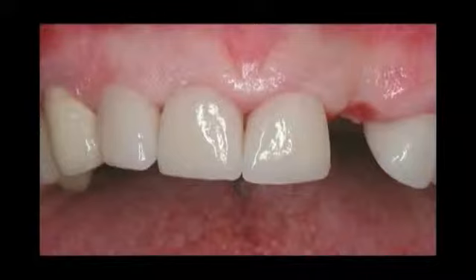Following removal of the bonded provisional bridge from teeth numbers 9 and 11 and placement of Empress crowns on teeth numbers 7, 8, 9, and 11, the 62-year-old female patient received local anesthetic by infiltration in the maxillary left anterior quadrant. In the edentulous site, previously occupied by tooth number 10, there was sufficient soft tissue dimension, adequate bone quality and height, and adequate interocclusal clearance with the opposing natural dentition for placement of a dental implant.